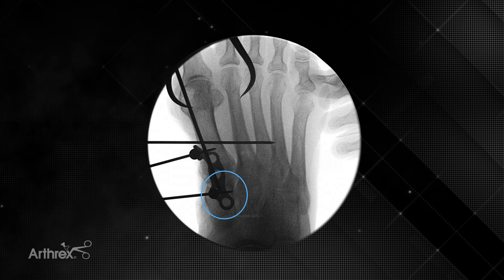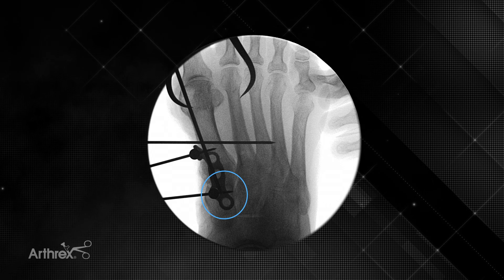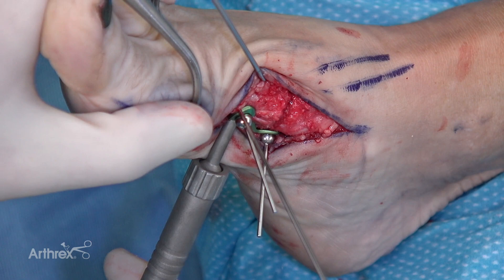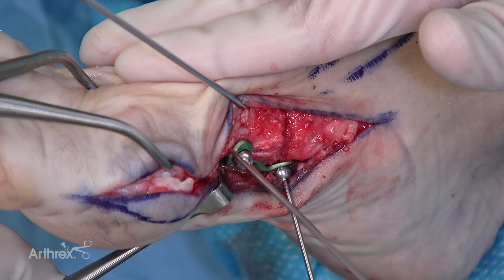In looking at this, I can see the most proximal hole is not too close to the joint. I can see the next hole distal, which has the BB-TAC, is not too close to the fusion site — so we're well centered within the cuneiform. Even though this is a non-locking screw, I find it's easier to put the locking guide in. So 22 — let's put in a 20. Very nice. Let's take our BB-TAC out.